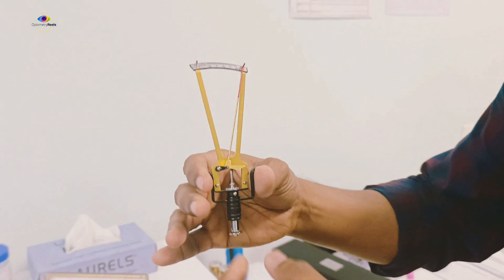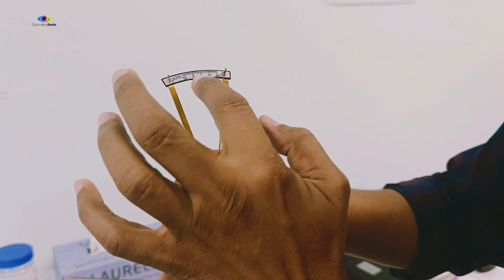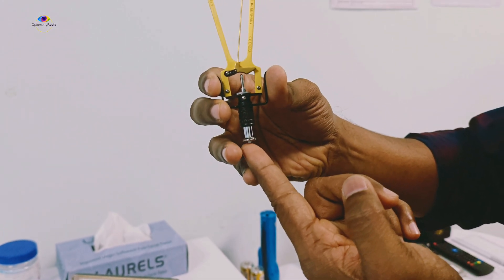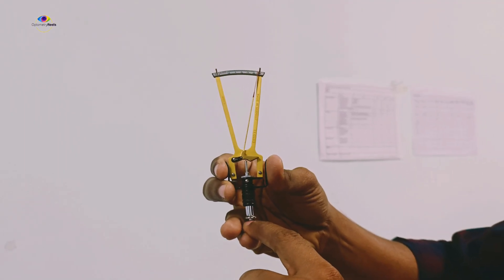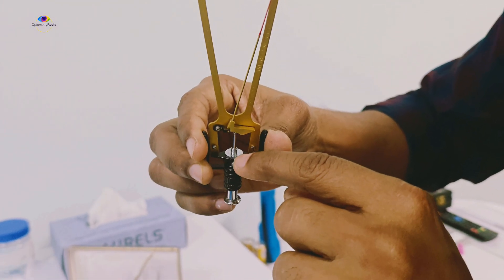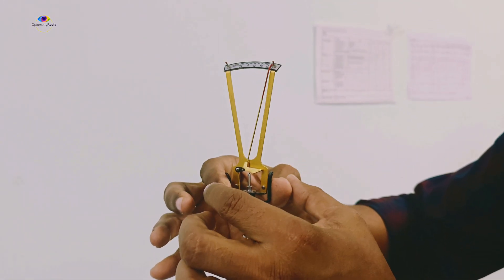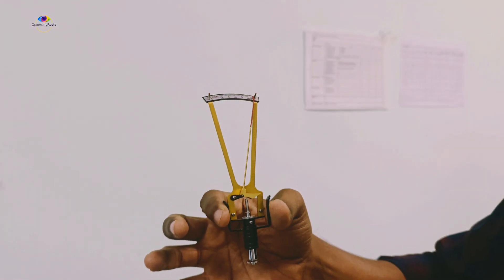Before I show you how it is done on patients, I would like you to understand this instrument. This instrument is based on the principle of indentation. It has a scale and a needle. This is the plunger which rests on the cornea, and the amount of pressure exerted on the cornea is reflected on the needle. It comes with an inbuilt weight of 5.5 grams. This is the lever, and overall this is how the Schiotz Tonometer looks.